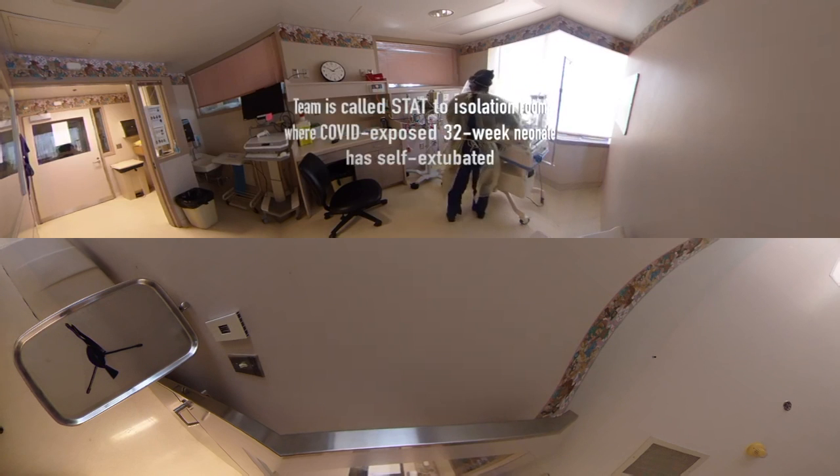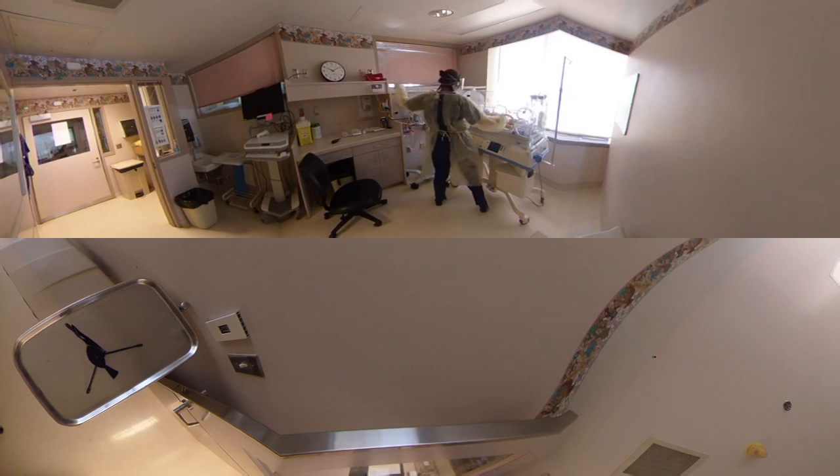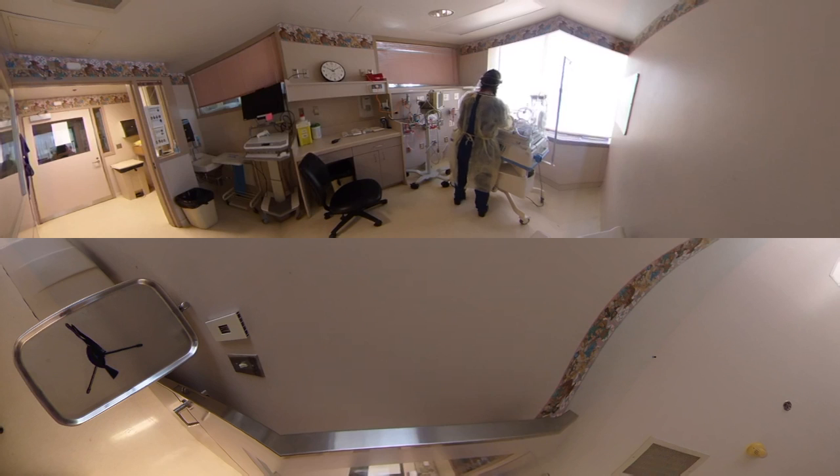Baby's desatting, heart rate is down — I think they self-extubated. Can I help you? Yeah, I need a team. I think I need you, they self-extubated. I'm bagging.